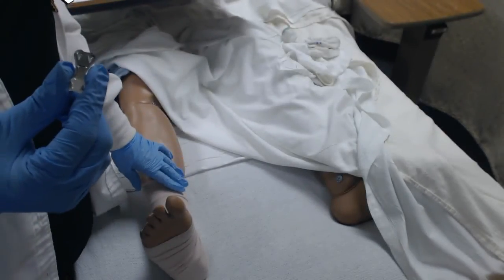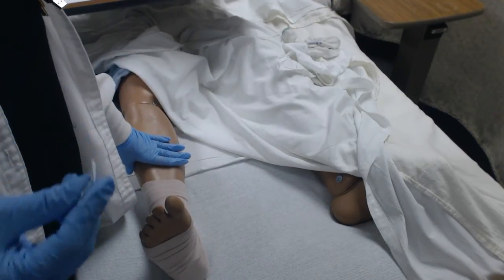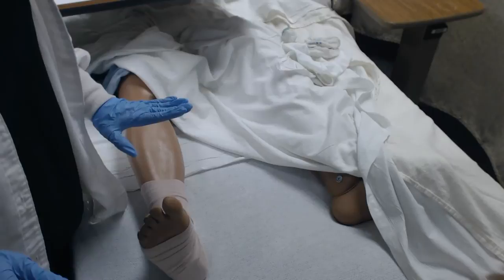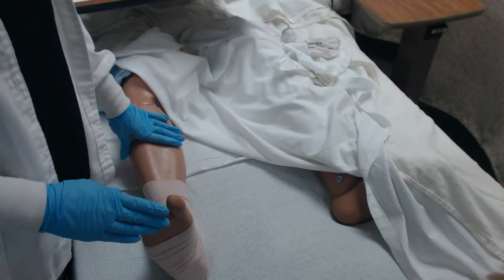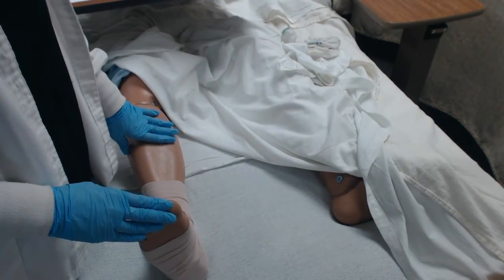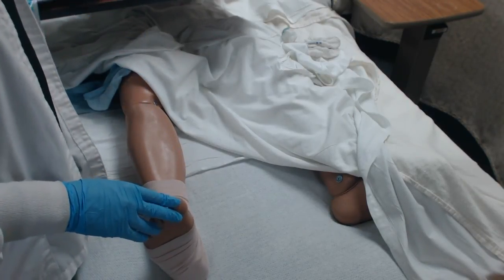These can actually go into the patient's skin. Typically their skin is fragile and it can cause a wound. So we do not want to use those. What we're actually going to have you use is a piece of tape that would be dated, timed, and initialed. So you want to make sure you have that piece of tape ready with the date, time, and initials for the patient.